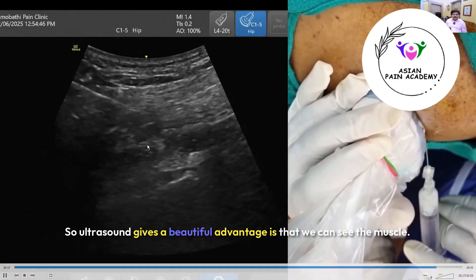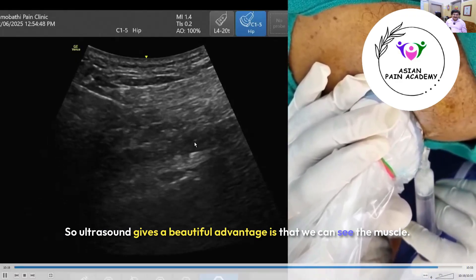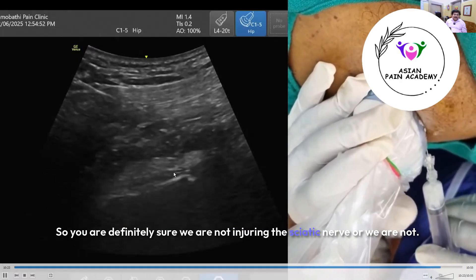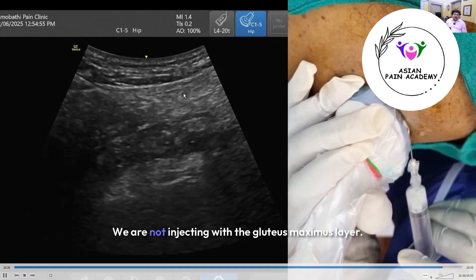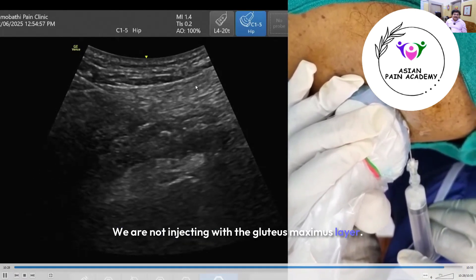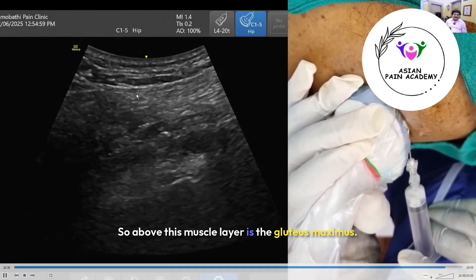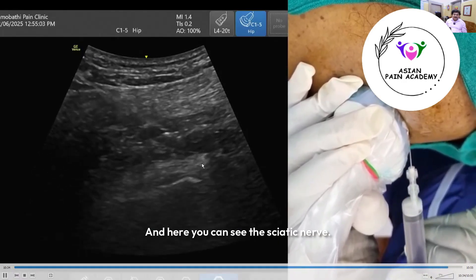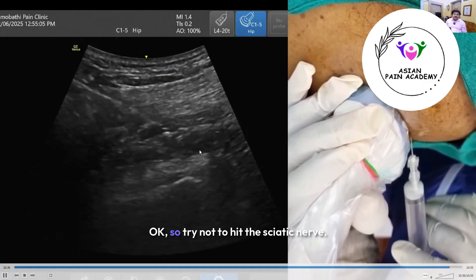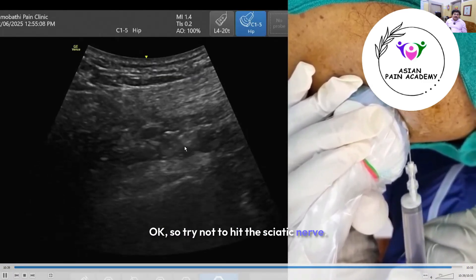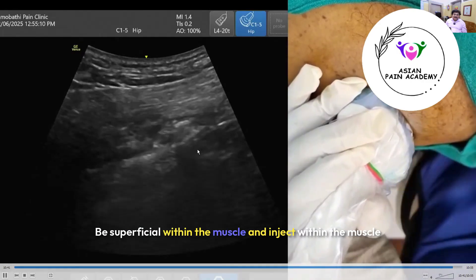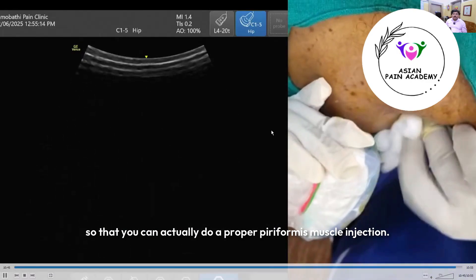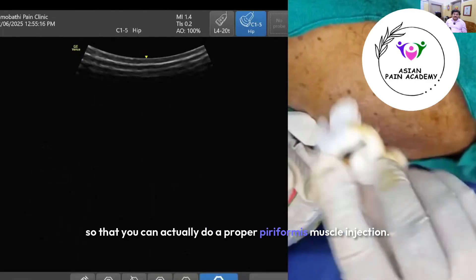Ultrasound gives a beautiful advantage in that we can see the muscle clearly. We can be certain we are not injuring the sciatic nerve and not injecting superficially into the gluteus maximus layer. Above this layer is the gluteus maximus, this is the piriformis layer, and here you can see the sciatic nerve. Stay superficial within the piriformis muscle and inject within it to perform a proper piriformis muscle injection.